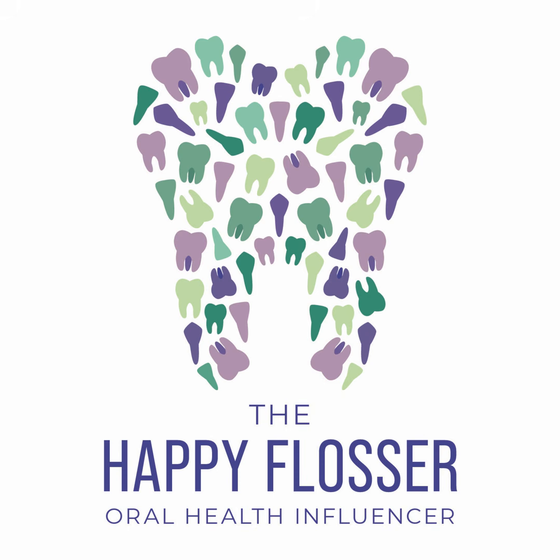So if you find something and you're not quite sure what you're looking at, think about the shape, the size, the nature of the borders that you're looking at. What's the internal architecture? Is it clear? Is it radiolucent? Is it radiopaque? Does it look kind of cobwebby? Does it look like a bunch of bubbles? Is it what they call unilocular, one circular area?